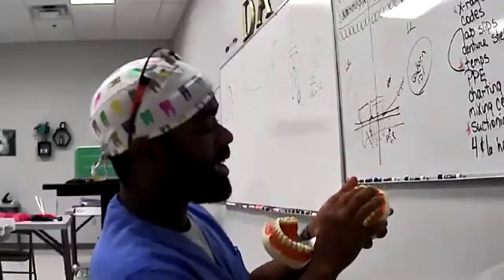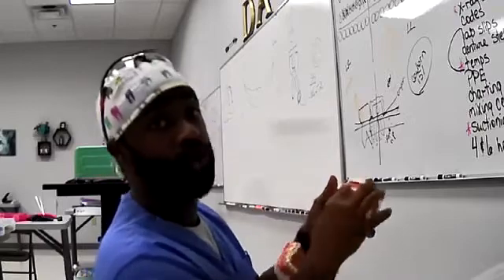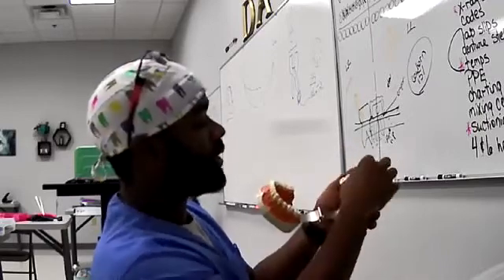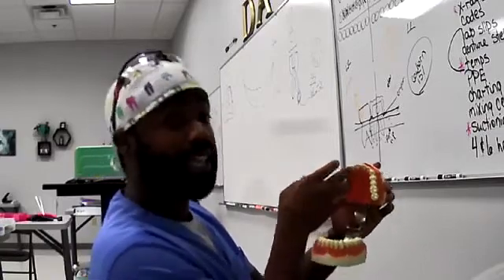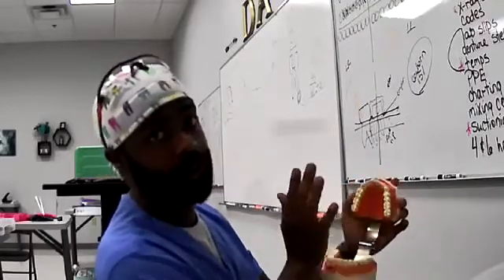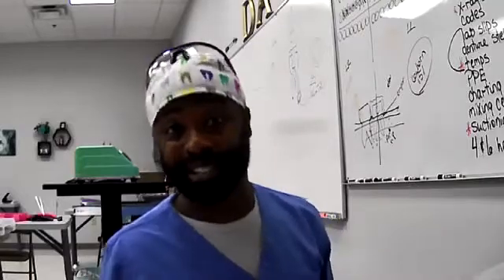If we are doing the incisor, most likely what they'll do is start off with the Tofflemire, but then finish with the mylar strip. Because this doesn't have the grooves like these teeth do. So they could just put it down there and start the little build up. But once they need the tooth to be as flat as possible, they would have to take the Tofflemire band off and put the mylar strip on. That way, this is still flat. You don't want it to be round. You don't want to throw off anybody's natural bite or natural occlusion. That was another trick when I didn't know it was a trick until I asked.